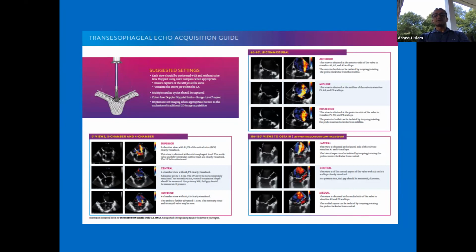Dr. Pasari is the echocardiographer who is actually involved in structural heart at MGH. A good friend. I think he's one of the best echocardiographers that I have met in structural heart. In any case, for the mitral clip procedure, you need expertise from your echo colleagues.